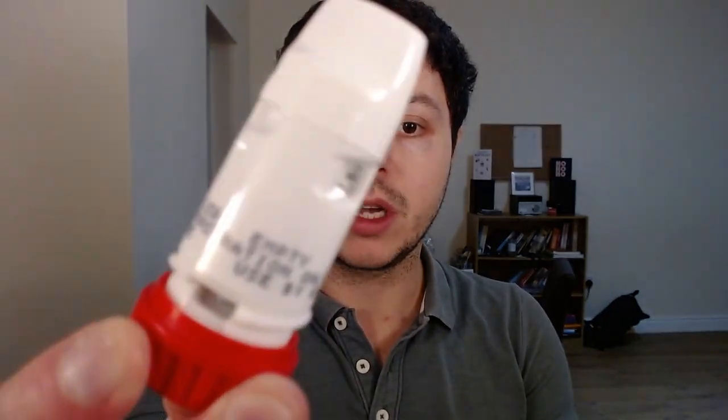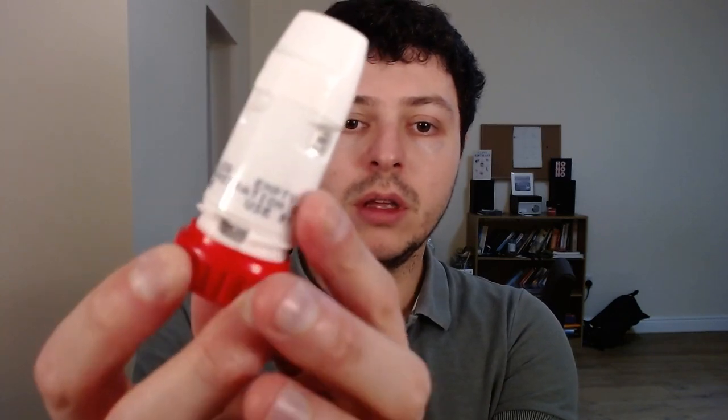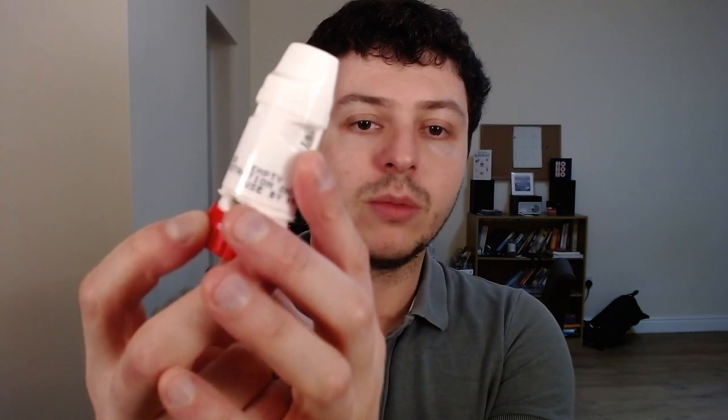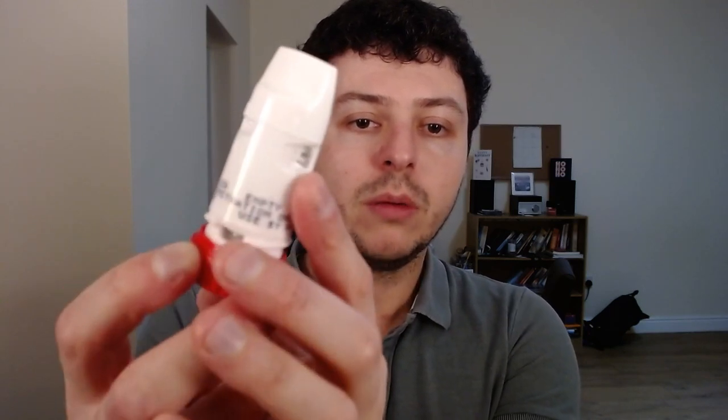It's got a little bit of a dose counter here. I'm not sure if the camera will zoom into it, but there is a dose counter — it's showing 80. And the dose counter is there and you've seen it.